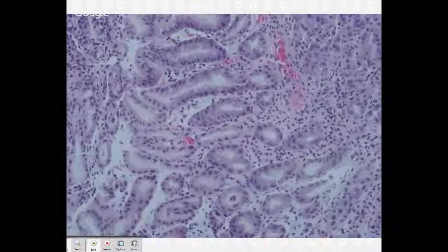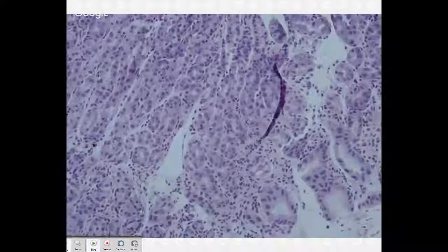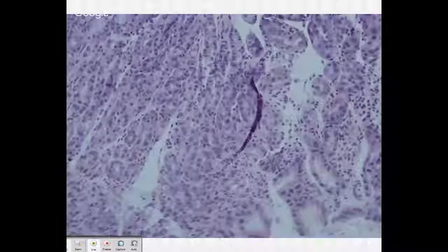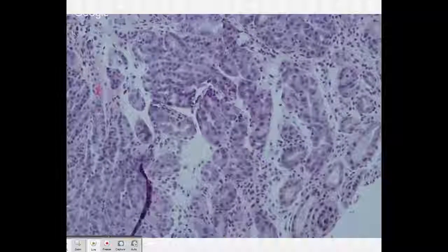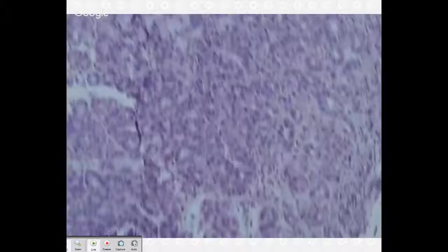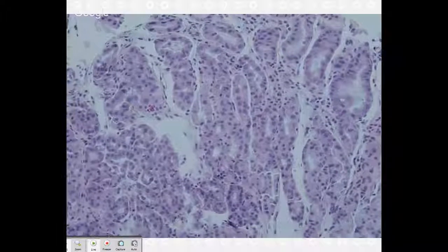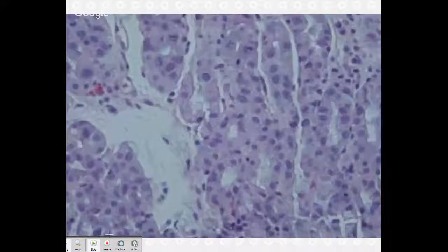So what do ring form mitotic figures make you think of? Why is that important? Medicine induced. What kind of medicine? Taxols. That's excellent. What else? And colchicine. Perfect. So is this cancer? What's your answer? No, it's not.